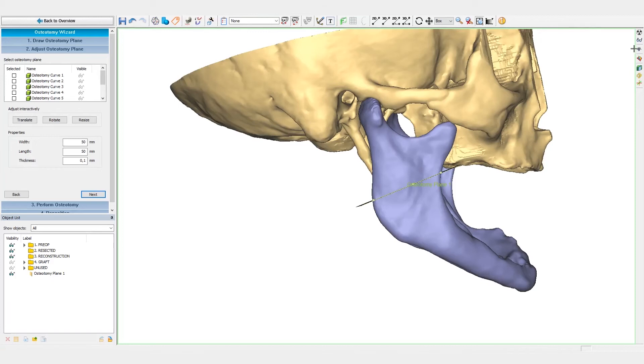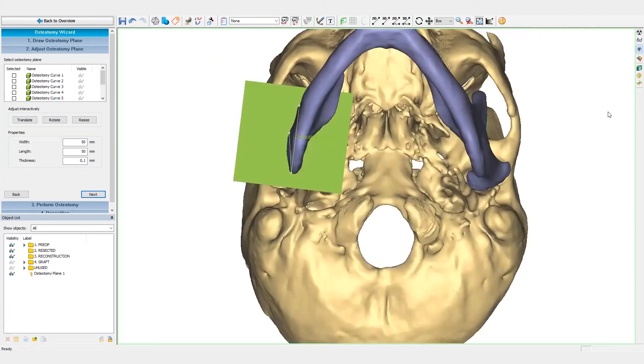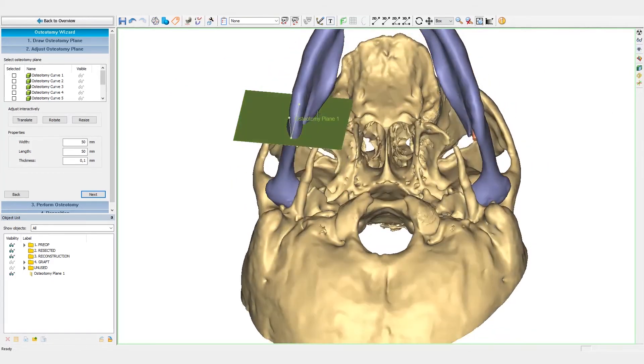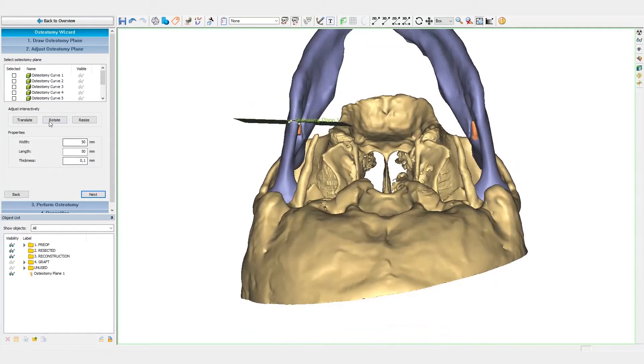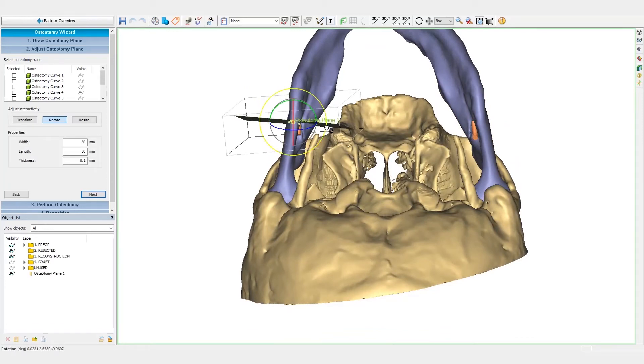The osteotomies can be adjusted if needed. We can double-check the tumor margins on the CT images.